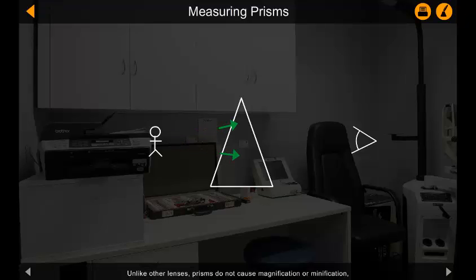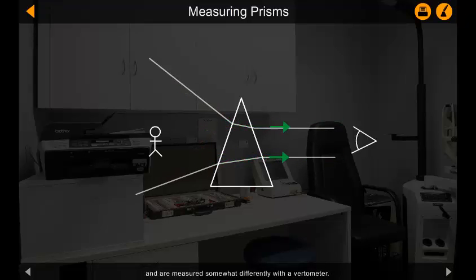Unlike other lenses, prisms do not cause magnification or minification and are measured somewhat differently with a vertometer.